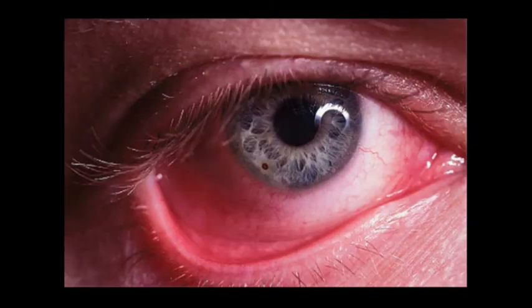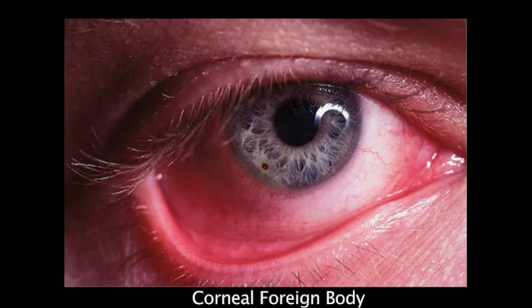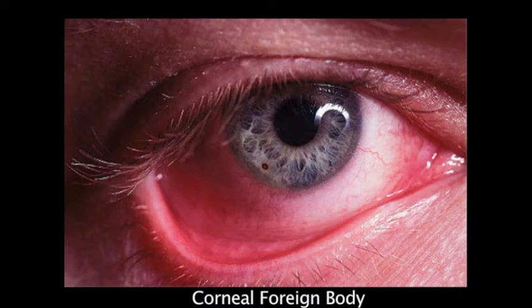This patient has a foreign body embedded in the cornea. Foreign bodies that do not enter the anterior chamber may be removed with a needle or metal or plastic spatula. After the foreign body is removed, a corneal burr may be used to remove any associated rust ring.